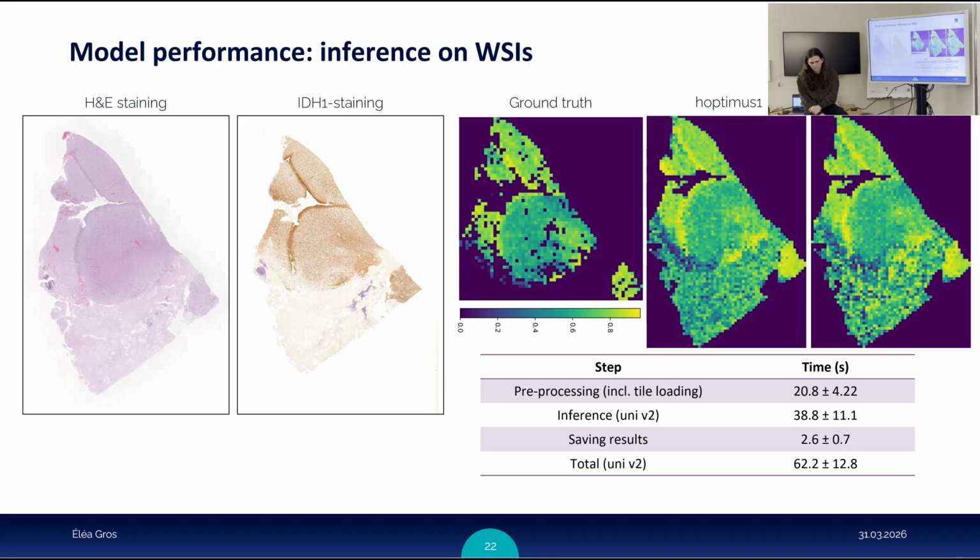Yeah, maybe to amend this, you could include a probability in some way, how secure the model is in predicting what is here, or in segmenting the tissue correctly. And then you have two kinds of modalities in one image. I don't know how to display that. I mean, if you know the size of the patch that you would use for neuropathology, you could just take the patch which has the higher tumor cell content in this 0.3 centimeters region, and maybe take first the top 3 matches or something like this to guide the analysis that would then be performed.